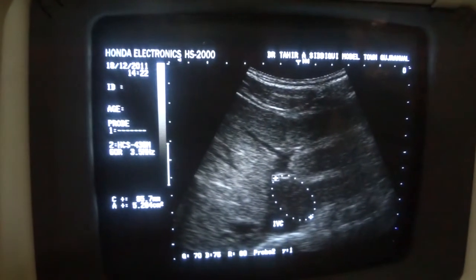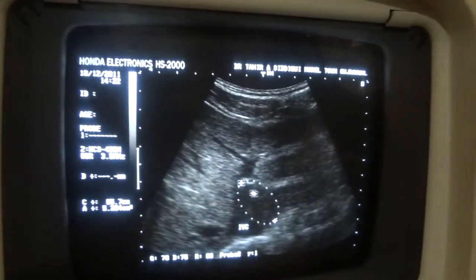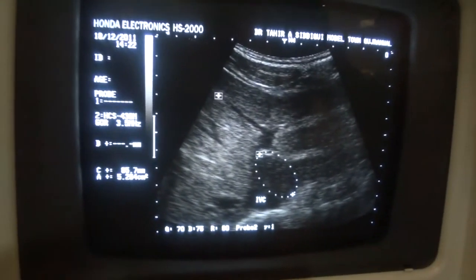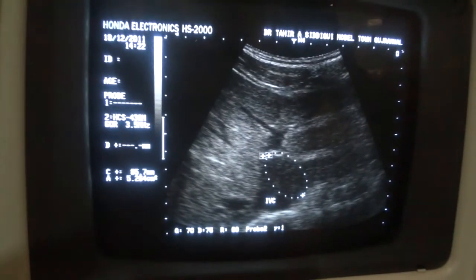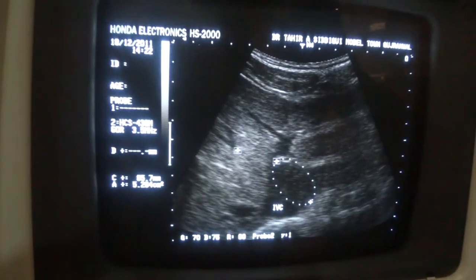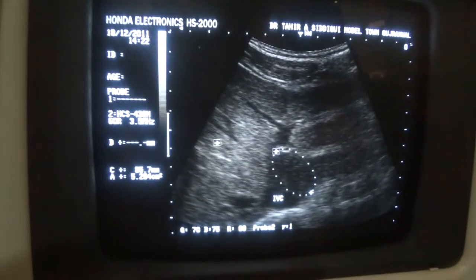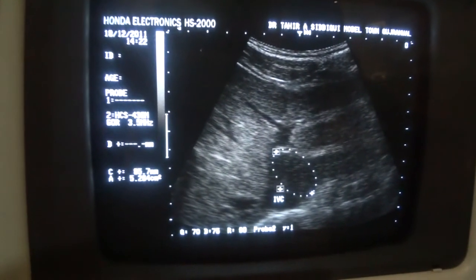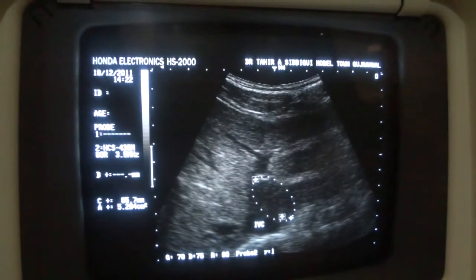Now if you look at the caudate lobe of the liver, this area is hypoechoic compared to the rest of the liver. It is less bright than the rest of the liver. The left lobe of the liver is brighter. The caudate lobe is hypoechoic — it is less bright.